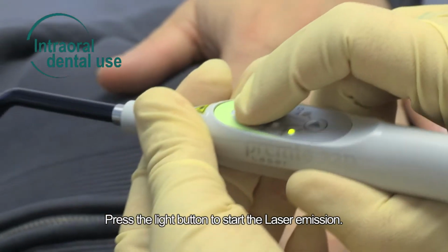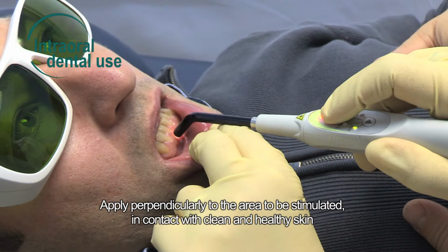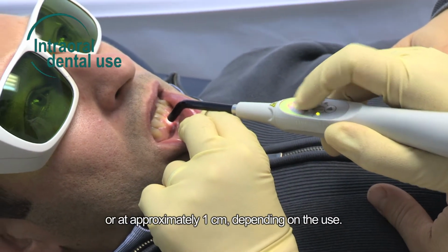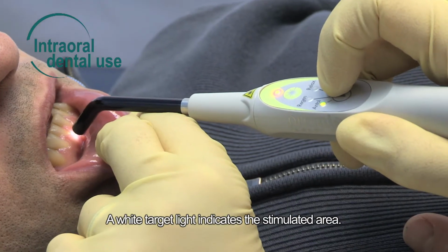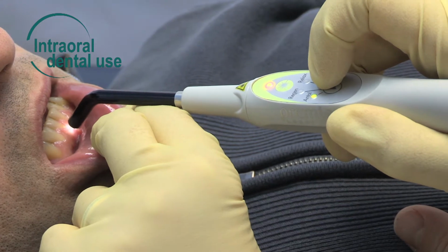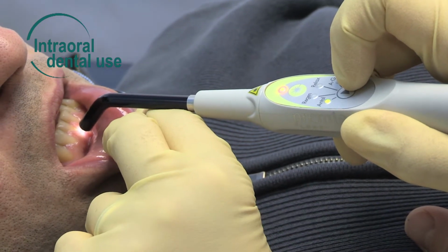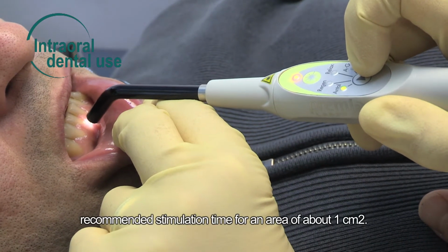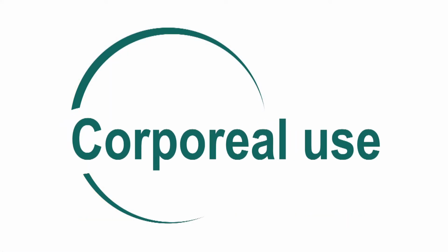Press the light button to start the laser emission. Apply perpendicularly to the area to be stimulated in contact with clean and healthy skin, or approximately 1 centimeter depending on the use. A white target light indicates the stimulated area. A click and an orange LED will both confirm the laser is emitting. There is a beep every 30 seconds. Recommended stimulation time for an area of about 1 square centimeter.